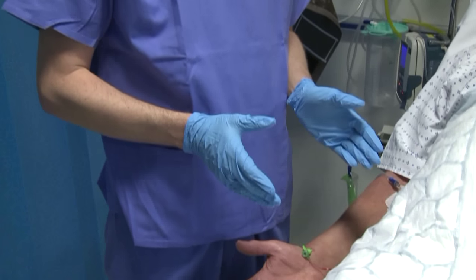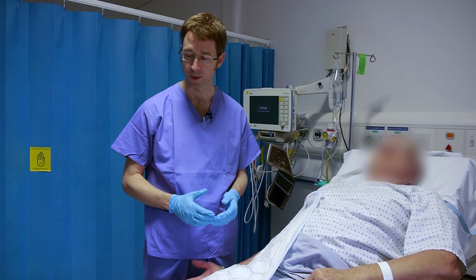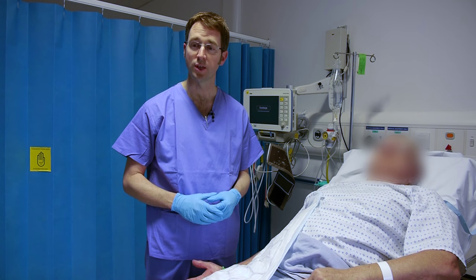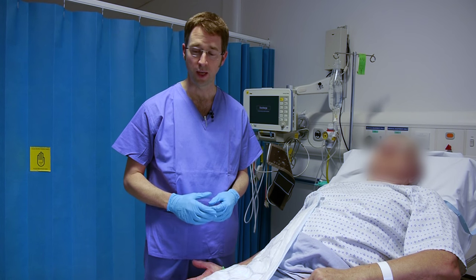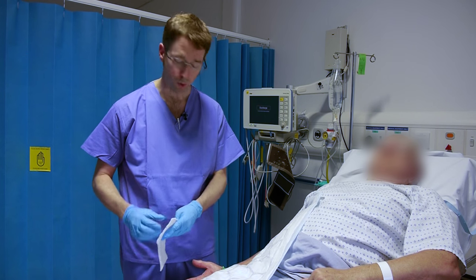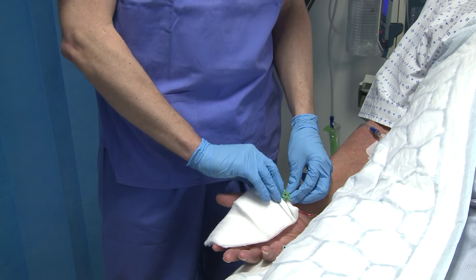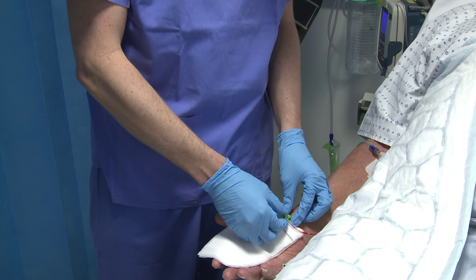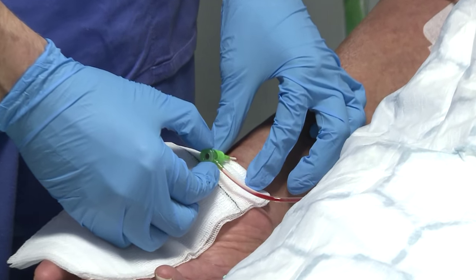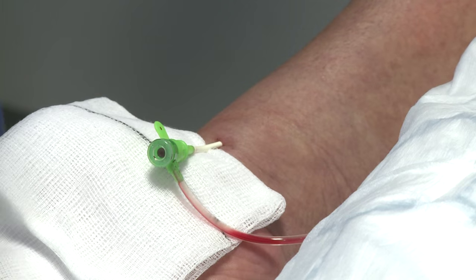We would tend to remove the sheath at the end of the procedure within the cath lab environment. The first thing to do in order to transport the patient to the recovery or day case area is to withdraw the sheath, place the TR band, and then we worry about true patent haemostasis once we've returned to the day case area. So withdrawing the sheath now — this might be a little bit sore as it just comes out — we withdraw the radial sheath slightly before applying the TR band.